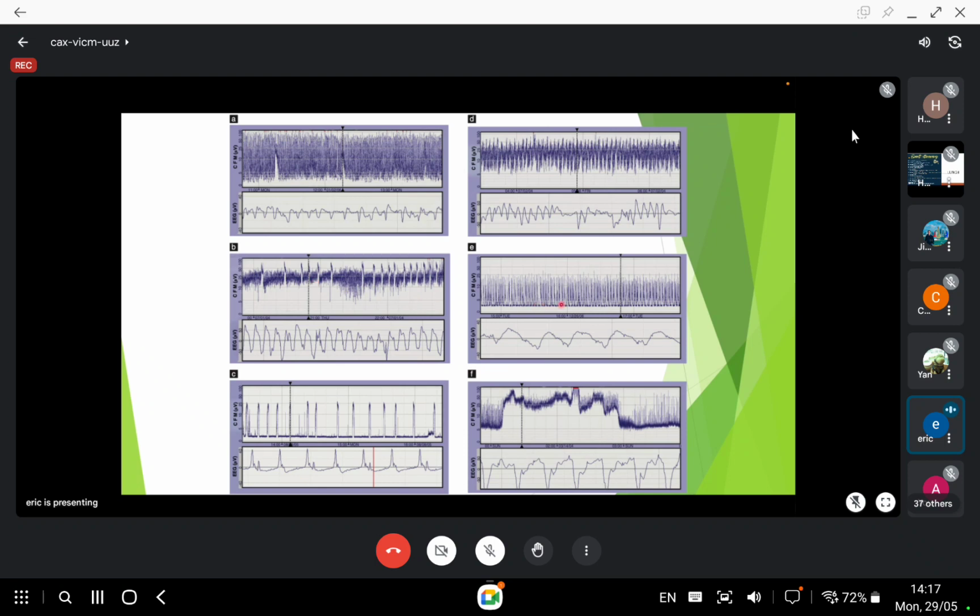Okay, and then here you can see the same things. And this is probably a status already. That means the seizure activity is beginning from here until here. And if you look at the time, this is midnight. So maybe 12:30 midnight until about 3 o'clock. And this is missed, okay? No one came to see the aEEG.